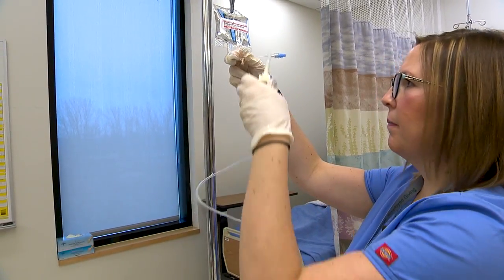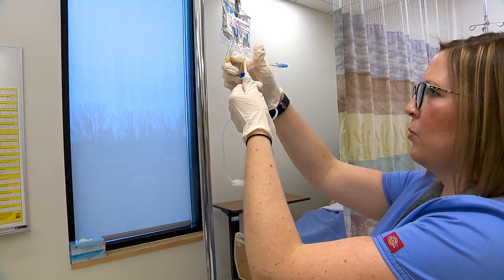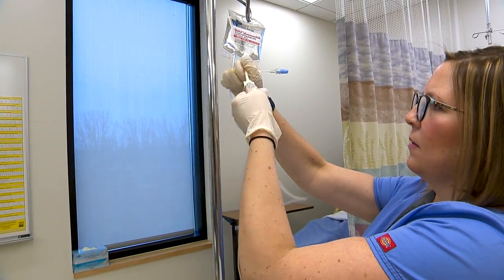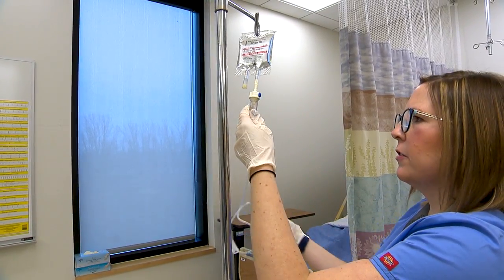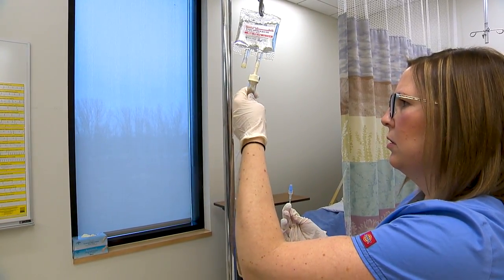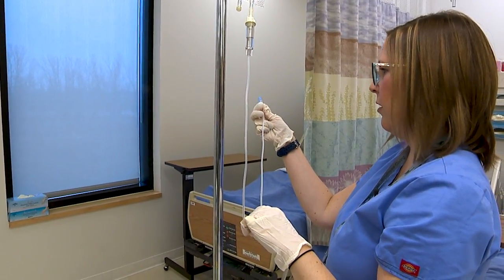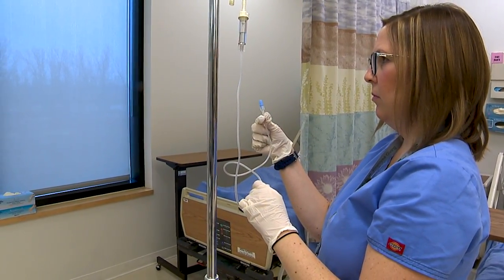Pull the stopper. Spike, push, and twist. Okay, fill the drip chamber about halfway again. Okay, now I'm going to carefully prime this, again, without getting air in the tubing.